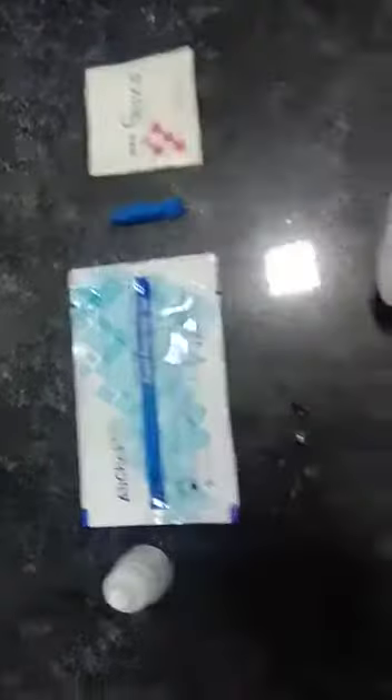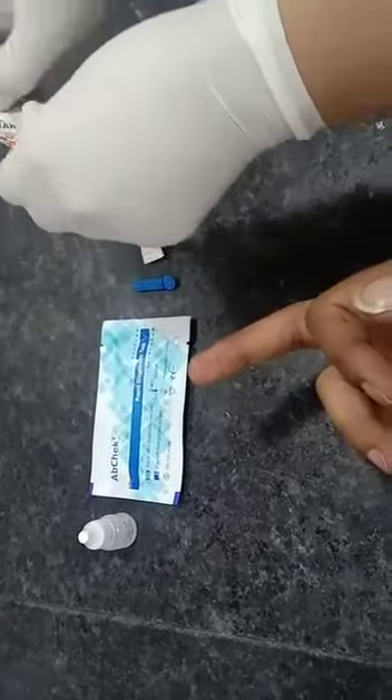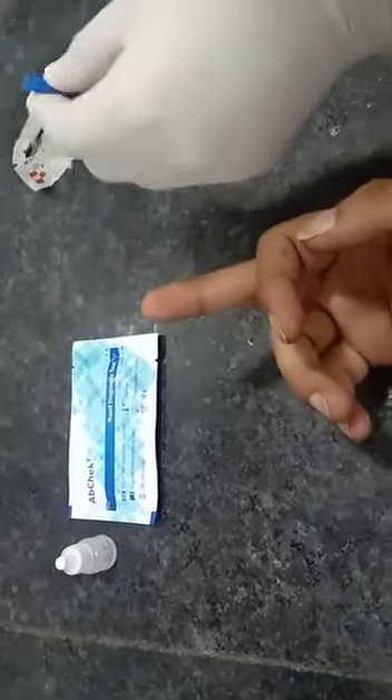Wipe the finger with the help of an alcohol swab and let it dry. With the help of a lancet, prick the finger, take one drop of blood, and dispense on the sample well.